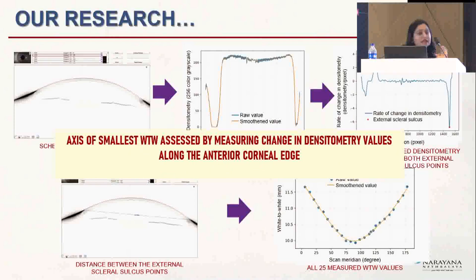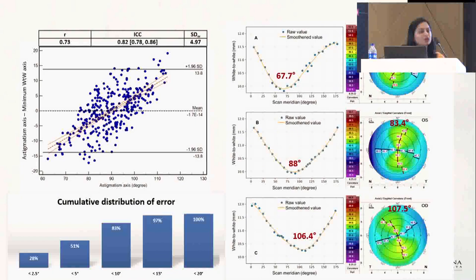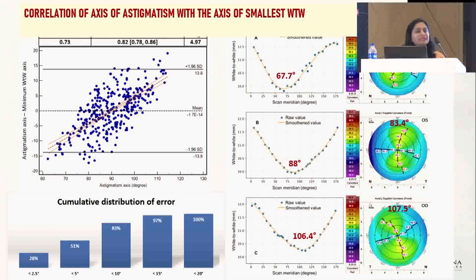So we did a detailed evaluation on a few patients, and we found that if the white-to-white was 67.7, if that was the lowest white-to-white, the steep axis was around 66. Out of these patients, 83% showed that the lower your white-to-white, that's where the steep axis is going to lie. We are still working on it. Once we have clear-cut data on this, we'll be able to explain it better.